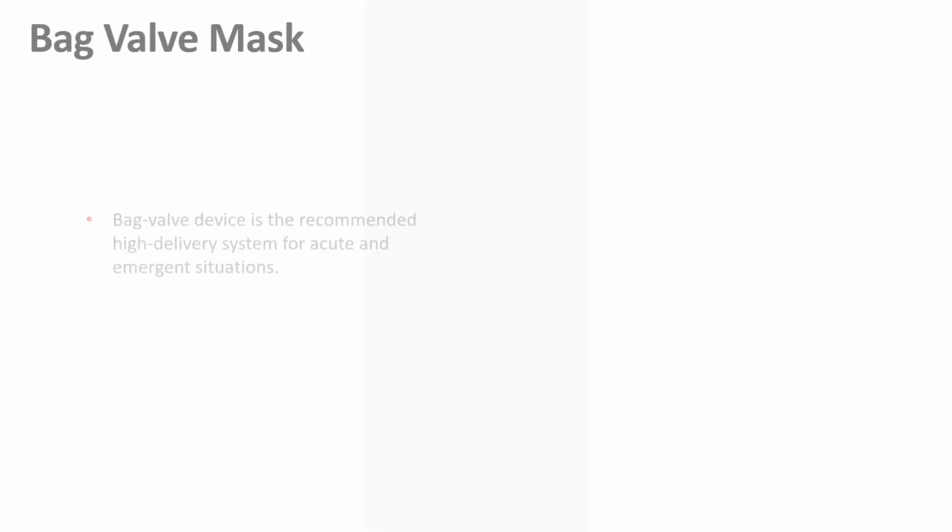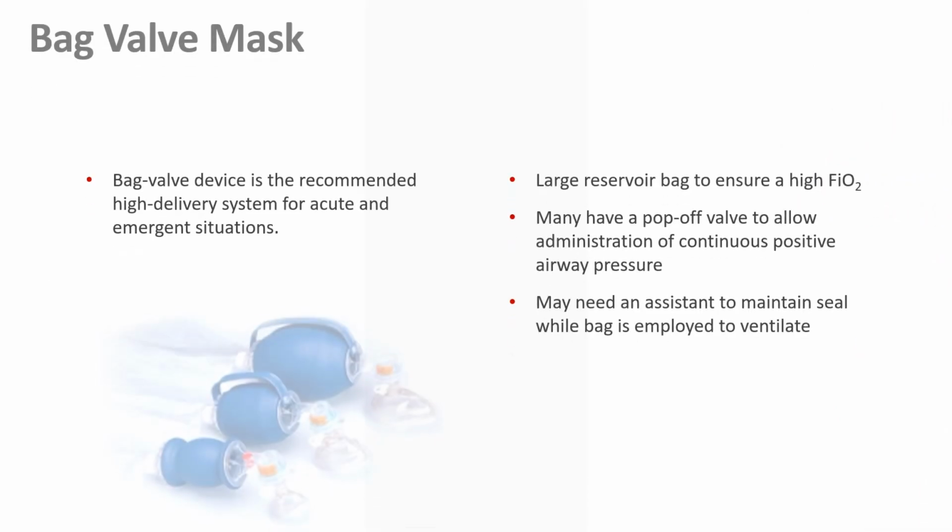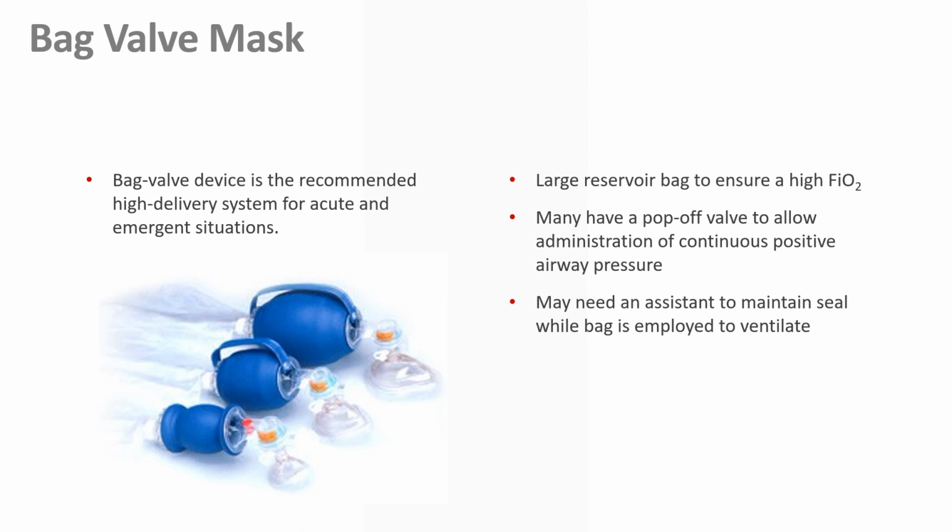Bag valve mask, it's got some problems. What's the number one problem? I don't expect you to know. I made it up myself. It's hard, like you said, if you don't do this every day, it's hard to get the right position, the seal. Coordination. Yeah. It's also made out of plastic.